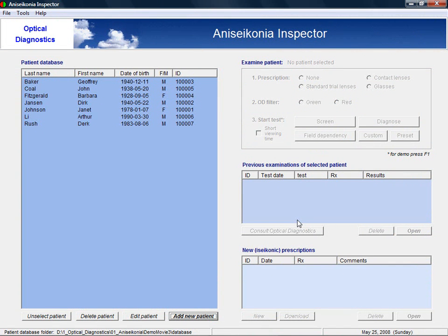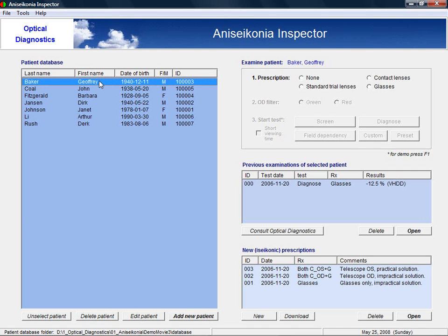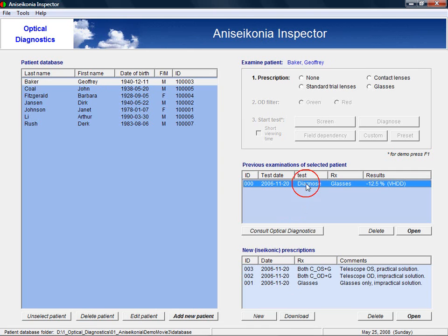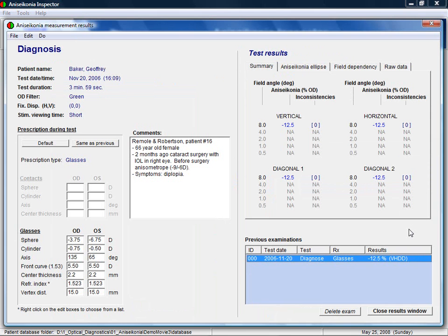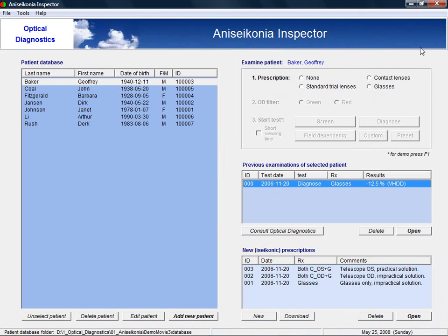With each patient, a series of previous aniseikonia examinations is associated as well as possible new aniseikonia correcting prescriptions. After an examination has been selected, it can be opened to view or edit the test results. The same holds for a new prescription.